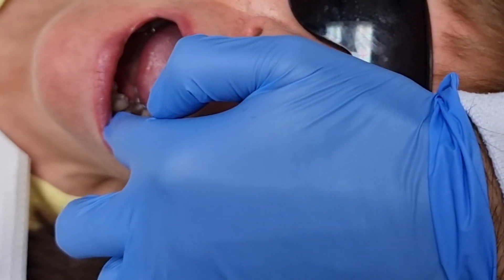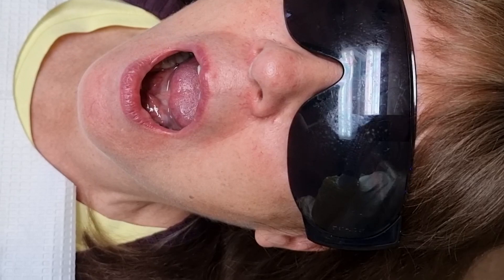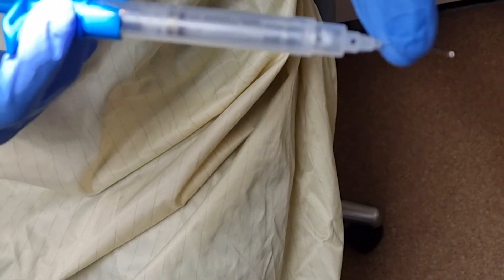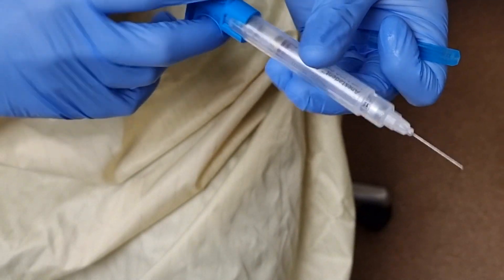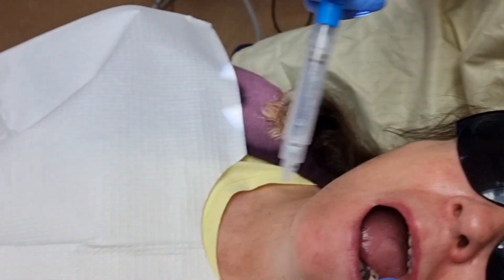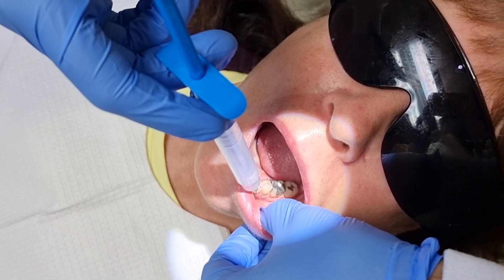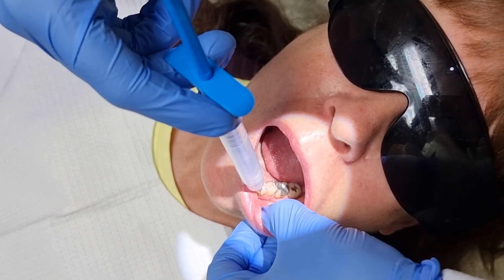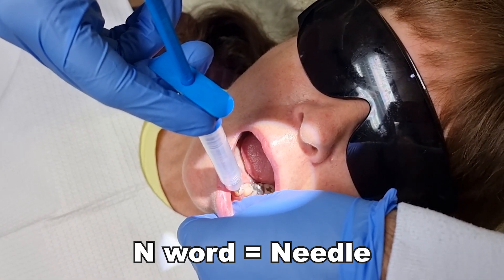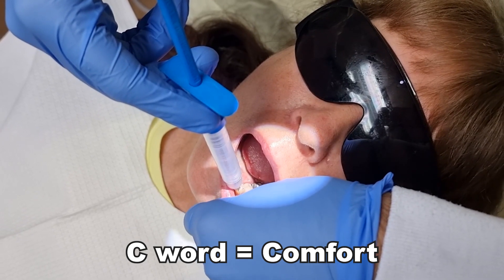By now the numbing gel has had sufficient time to work. I'll be using articaine hydrochloride. There's a little sign indicating the direction the bevel is pointing, so I'll point that towards the mucosa. I say to the patient: there'll be some tugging and pulling of your cheek. We're going to the sulcus area, going very slowly, just entering at the mucosa entry point. As I do that, I'm vigorously massaging the cheek. At no point have I mentioned the n-word or anything like that — the c-word is comfort. We like to use that word.